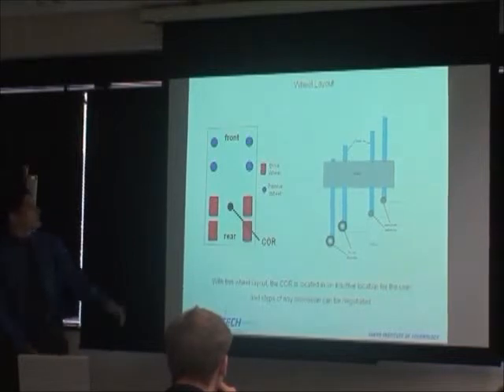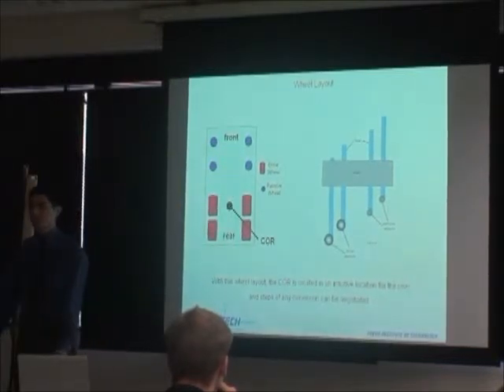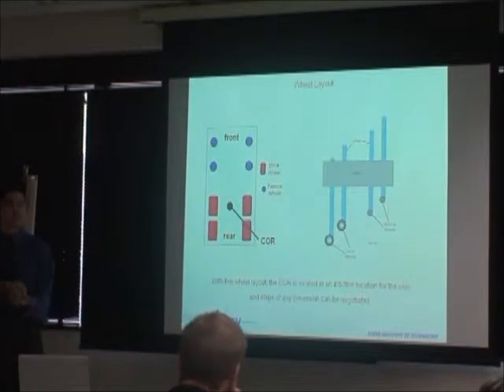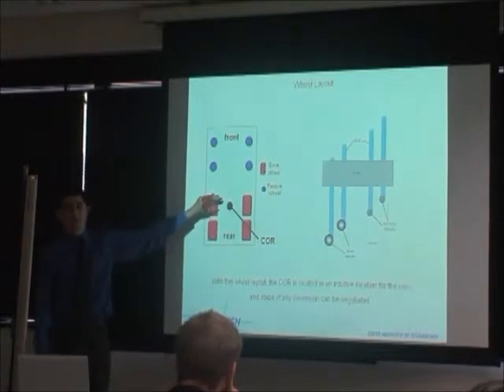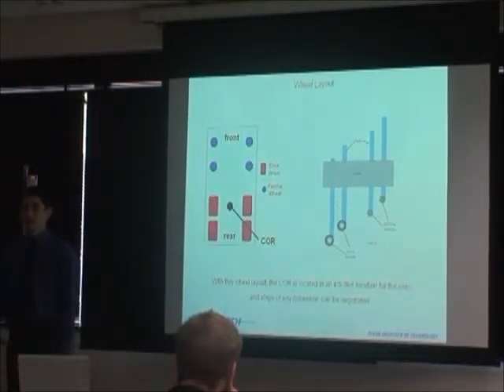Also, I forgot to mention that normally you want to have drive wheels at all four corners in order to support the weight of the wheelchair and ensure that you have sufficient traction for all the wheels. However, the center of gravity of the vehicle with the wheelchair is slightly towards the rear. So there is sufficient normal force on the rear side of the vehicle to provide forward locomotion.